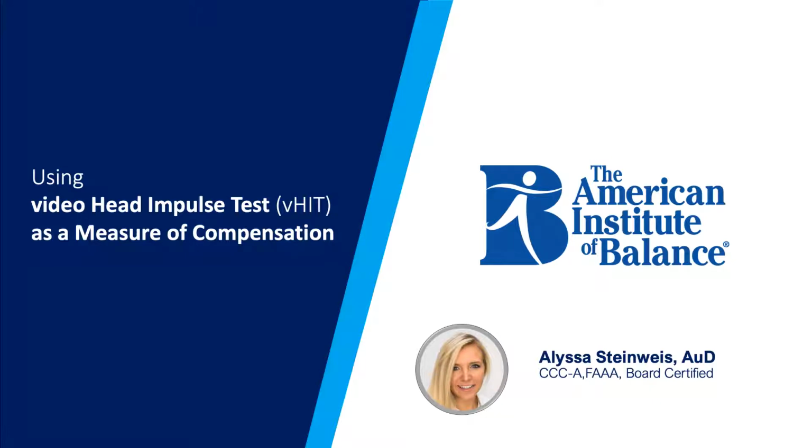During this informational video, I'll be discussing the role of using video head impulse testing, or vHIT, in assessing compensation status as it pertains to a sample case study.